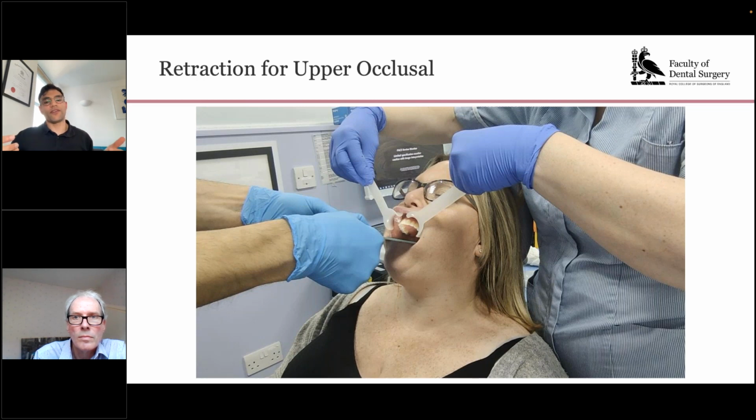So I think with a twin flash, you can probably get a more exemplary quality of photograph, but it's more expensive and it's difficult to teach, and therefore less reproducible by other people.